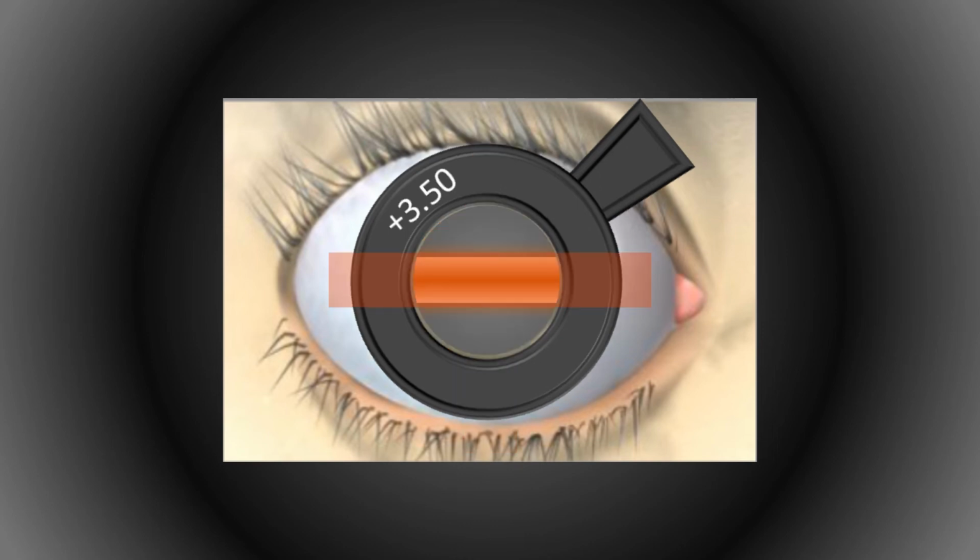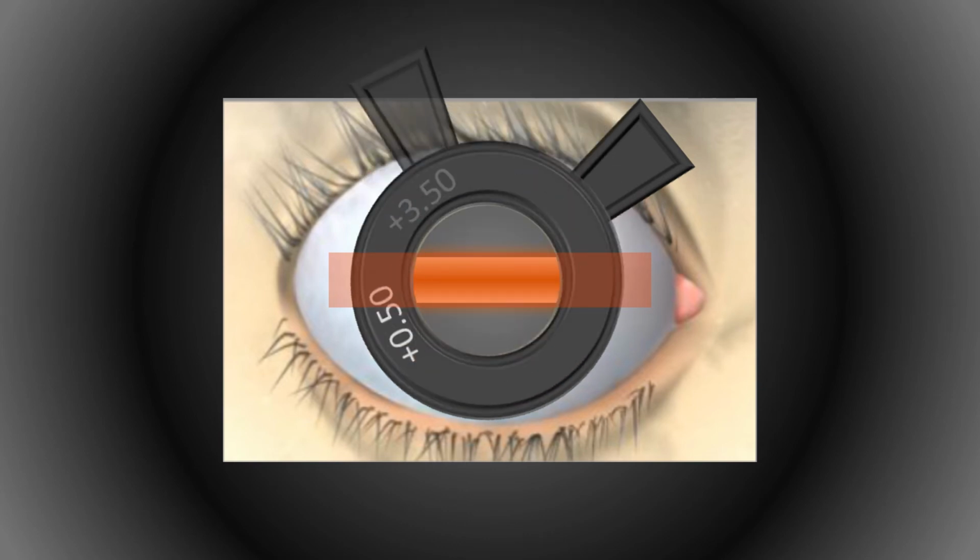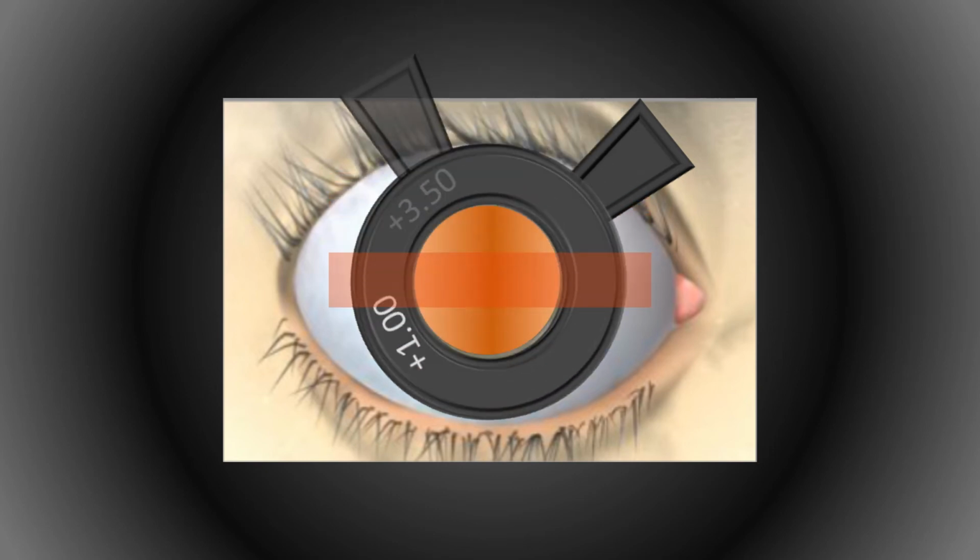Repeat the same, sweep the streak and observe the reflex. And we can see again "with" movement here. So add more plus over plus 3.5 diopter, and again observe the reflex through the lens, and it is still "with". So change the lesser plus power with the higher plus power and observe the red reflex through the lens. This time it seems neutral.